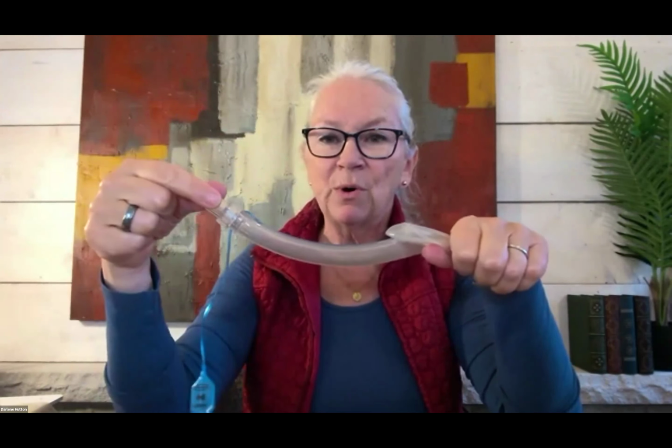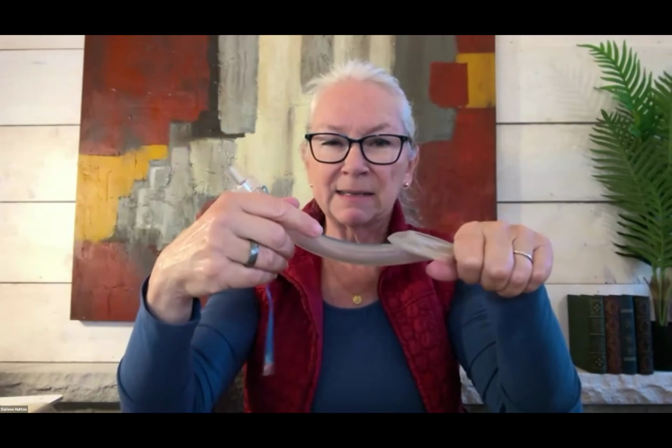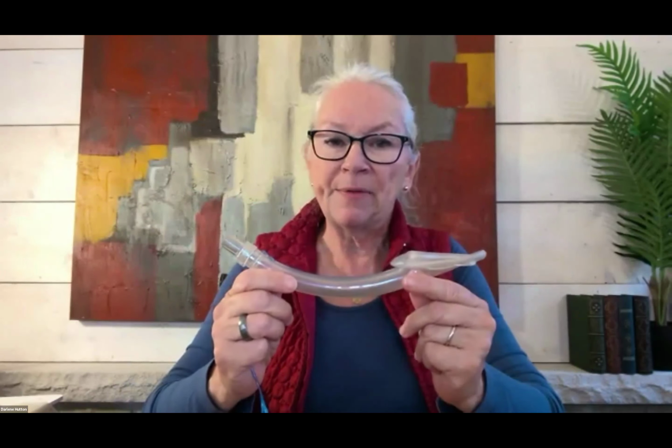So you would then go ahead and inflate your cuff. You would attach your filter, then your ambu bag, and you would deliver breaths, 1 breath every 6 seconds. Sizing for this is based on the patient's weight. So an average size for an adult, 30 to 60 kilos, this would be about that range.